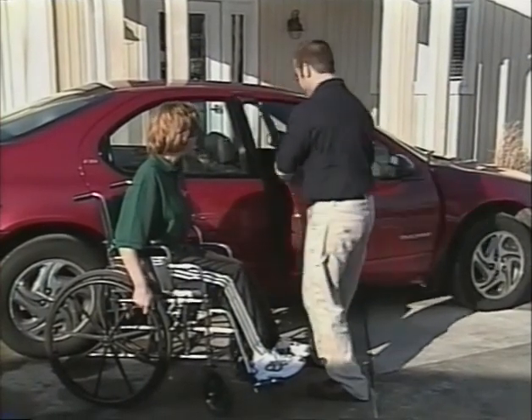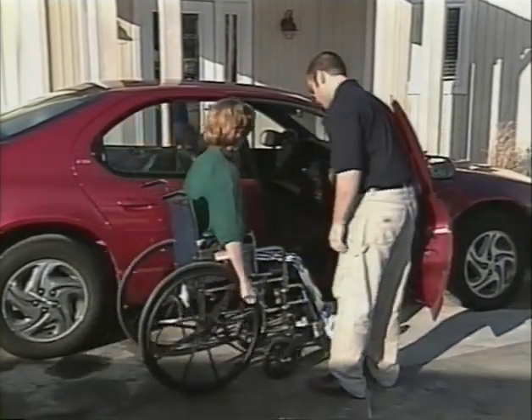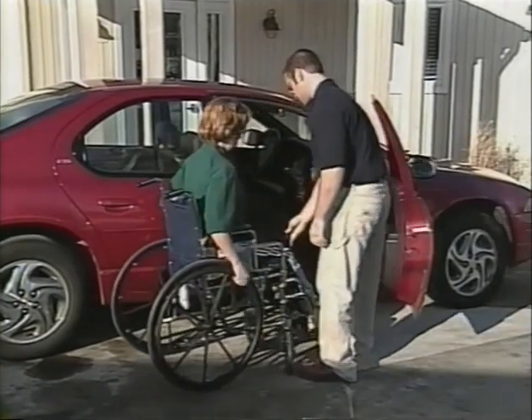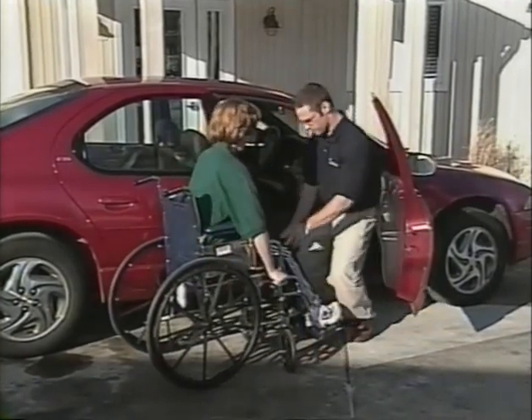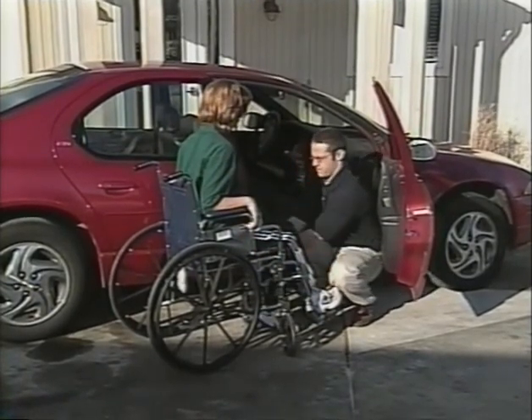Open the car door. Position the wheelchair as close as possible to the car. Make sure to leave enough room for the helper and client to stand and pivot. Lock brakes and remove footrests.